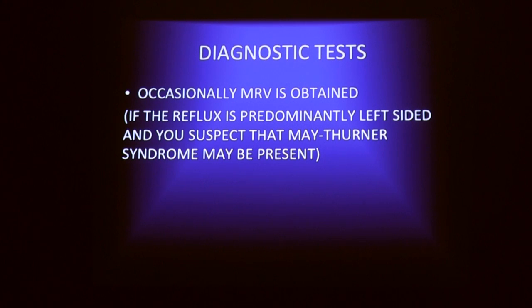So the left leg vein comes across and then meets the right leg vein, and together they go up as one vein with more things joining, kidney veins and other things, as it gets to the heart. Well, with an ultrasound probe, a lot of things get in the way when we try to look high. First of all, the IVC gets deep. Second of all, there's bowel and things in the way. It's harder to see. So sometimes if we have a suspicion there may be something else going on, we will order an MRI. Again, I'm the radiologist, right? So we do imaging and we're looking to see what's happening to that vein as it gets up on either side and meets the IVC. So on occasion, we do need an MR venogram to really finish the job of looking at the veins of the leg before we treat.